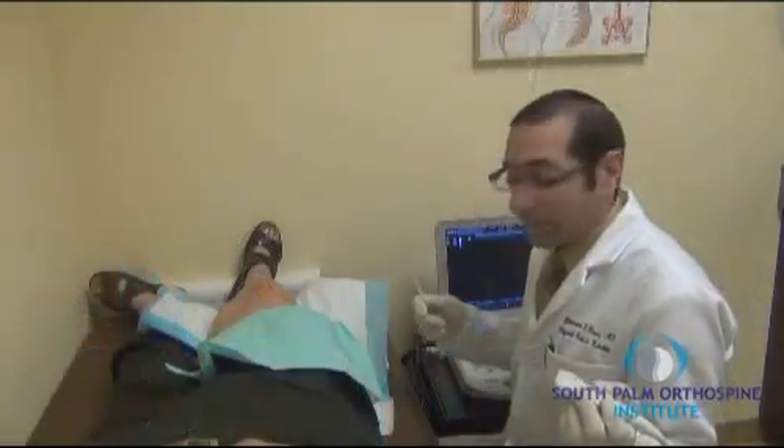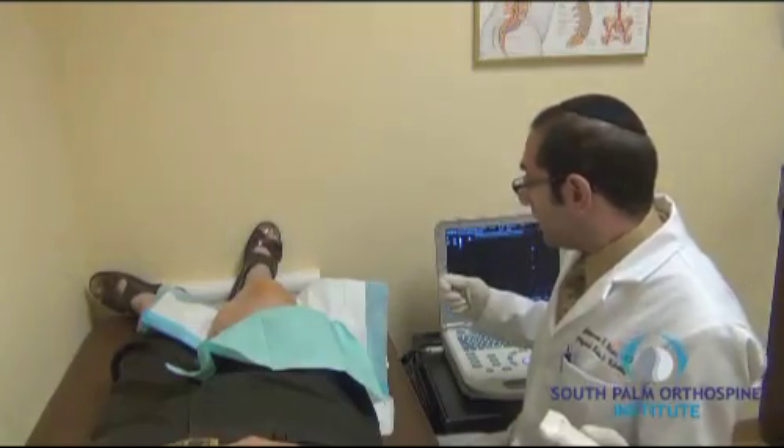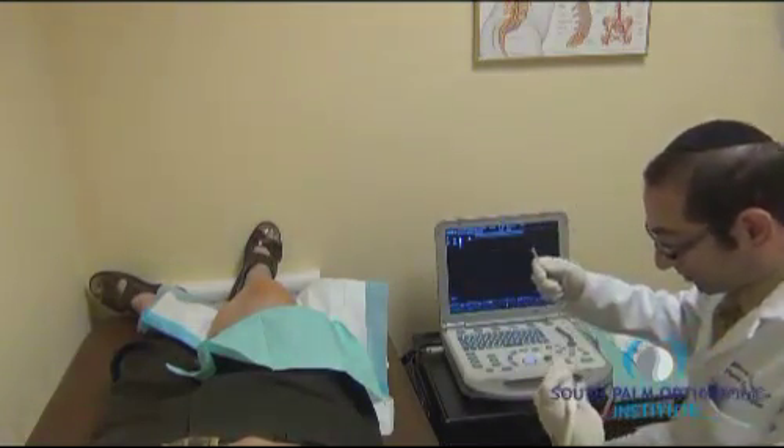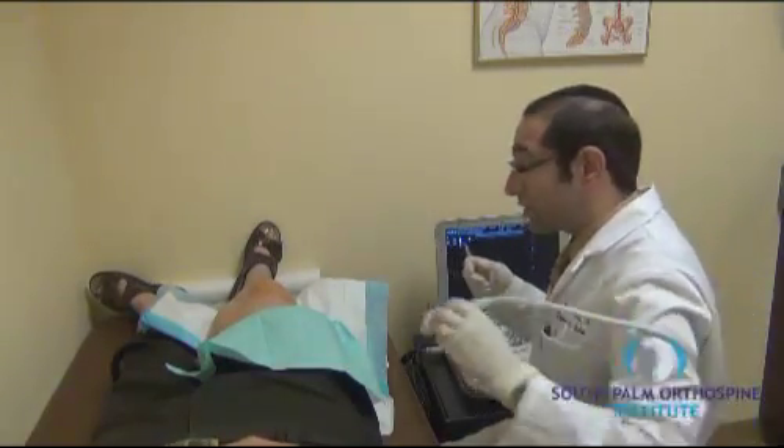Right knee. Ultrasound guided. A hyaluronic acid injection. The right knee has been prepped in a sterile fashion and we are ready to proceed with the injection.